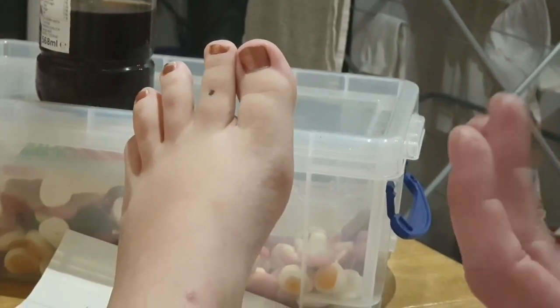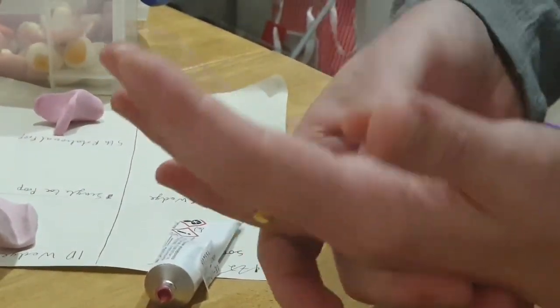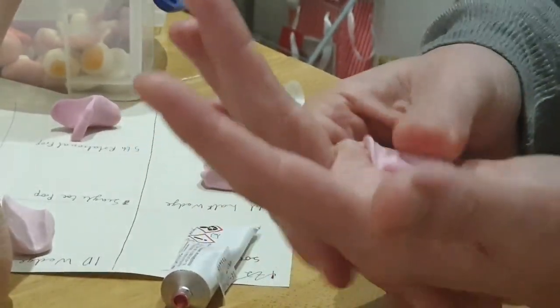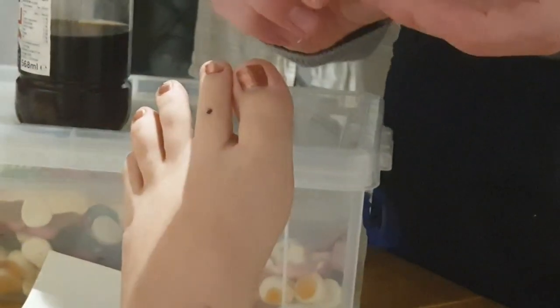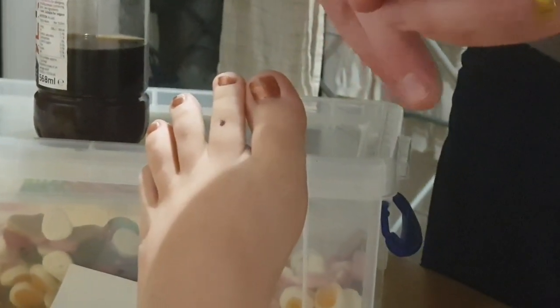So the usual thing — fold it into the middle until it's a nice uniform color, roll it into one homogenous ball. No creases. This one is a little bit tricky because you're going to have the two tails that go between the toes, and it's slightly thinner so you can rough shape it over your finger.